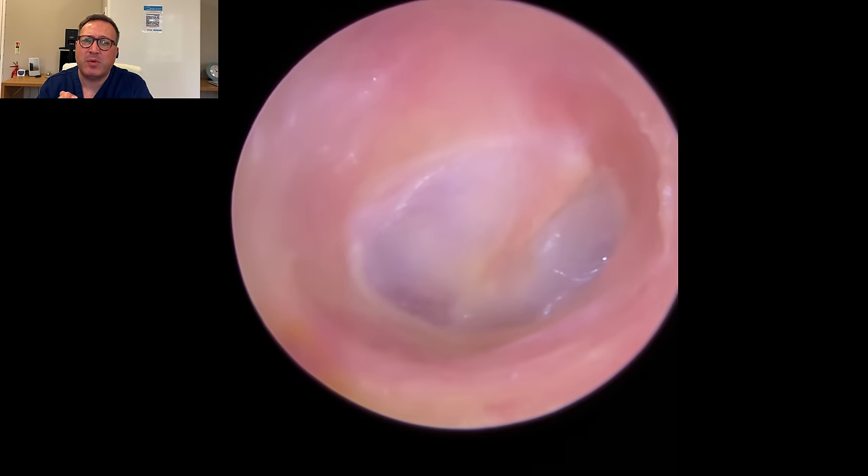If we can detach it from this right-side canal wall. But as we lift, you'll see the skin lifting - you can just see it there in the bottom right-hand corner. As you lift it up, see the skin peel underneath? So exactly the same problem with this ear as the first one - we've got this layer of dry skin really holding this in place. The patient will feel this moving in the rear canal but it won't be uncomfortable. Getting a good grip on this block, I'm trying to aim the end of the Zolna tube so we can tilt it to get a good grip. As we're pulling this forward, you can see the amount of movement - this wax should come out really easily, but you can see it's really holding in place. As we pull down, do you see it kind of draw out and stretch out of the canal? That's the skin that's embedded into all of this, just stopping us from pulling this out.